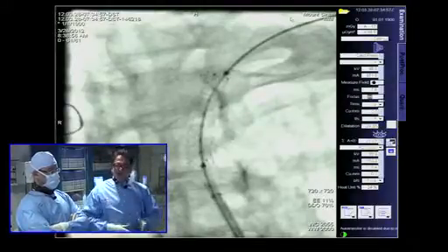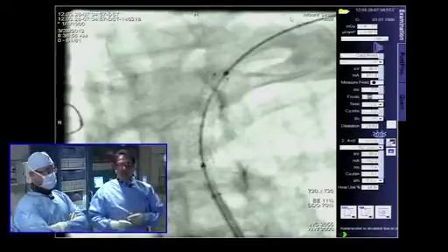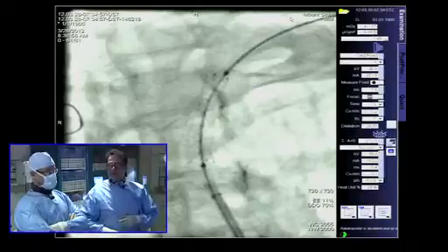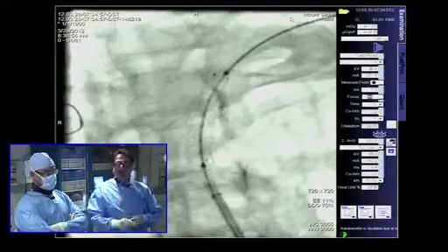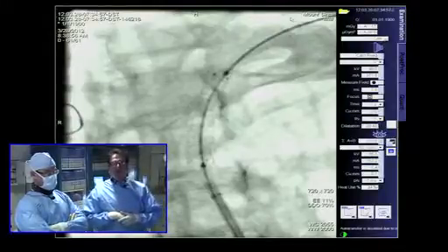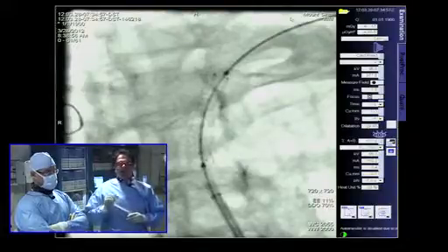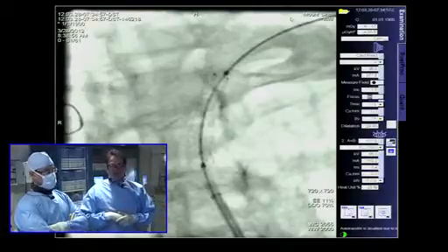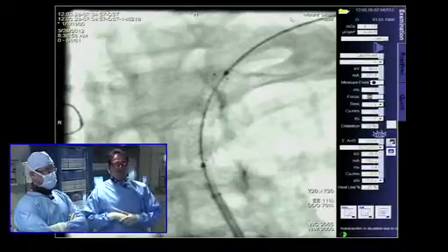because these vessels are obviously free floating and also can have perforation because of the severe calcification. Plus, as you go up slowly, you'll learn from the patient. So when she says, ow, that means that you're stretching the vessel wall. Number two, if she becomes bradycardic, you're actually stretching the adventitial plexus in the adventitia and causing her to vagal. These are clear indications of impending perforation. So you want to be extremely careful in these patients.